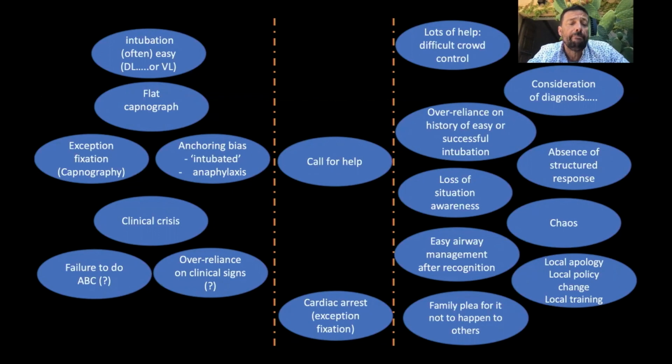So there's a call for help, and many, many people come and deal with this crisis. Usually this happens at or around the time of cardiac arrest, and the individual who's intubated the patient will explain that they've seen the tube going through the cords, they know the tube's in the right place, they've listened, and others will listen and hear the same. Cardiac arrest has usually occurred at this time, and we carry on with this exception fixation. Yes, I know about esophageal intubation, but this isn't. We must press on.